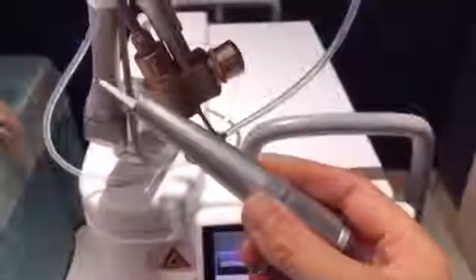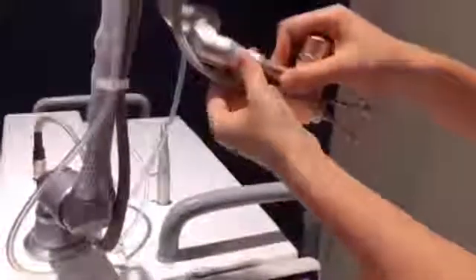In pulse mode, you should use this probe for cutting. Take off the pipe and remove it from the handpiece.